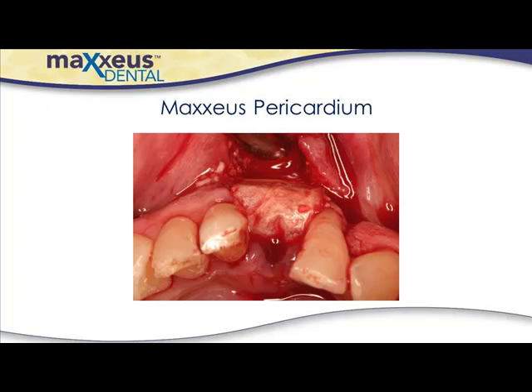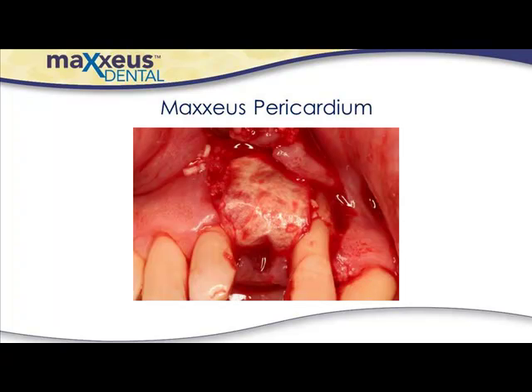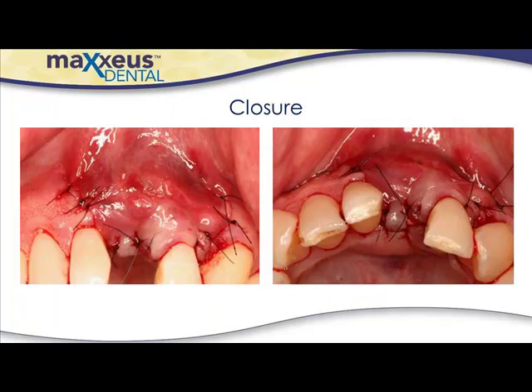Here is an occlusal view of a Maxxeus Pericardium barrier membrane that was applied for guided bone regeneration. In the facial view of the pericardium after application, note how the membrane lays on the graft nicely, without the need for tacking when it's hydrated. Periosteal releasing incisions were employed to achieve primary closure of the surgical site.